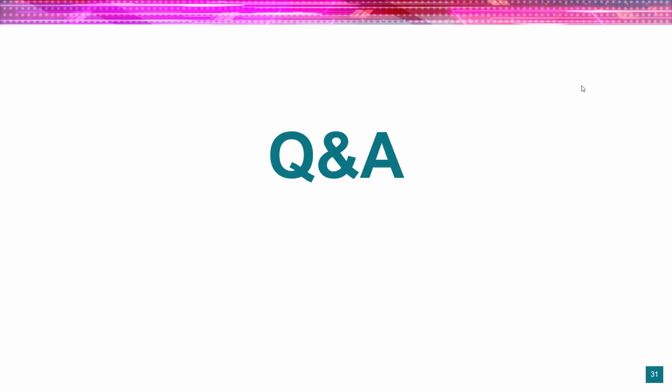So please go ahead and type your questions into the Q&A chat box at the bottom of your screen. In the meantime, while we wait, what are some common questions that you get, Iikia, from this particular tool? Because I know this is a very specific tool, and what are some of the things that people should know?